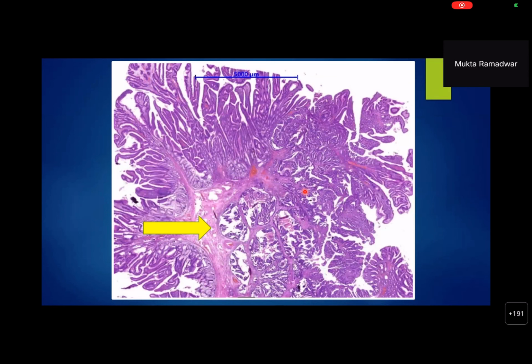Now, Dipali, can you take over next? Can you see anything more in this adenoma? Yes, ma'am. In this section, I can see there are glands which have a stratified lining with pleomorphic hyperchromatic nuclei. Can you move ahead, Dipali? We already decided that this is a tubulovillous pedunculated adenoma with low-grade dysplasia.